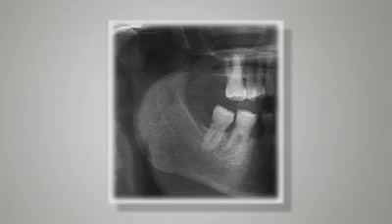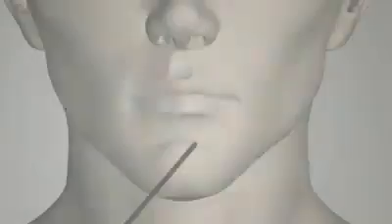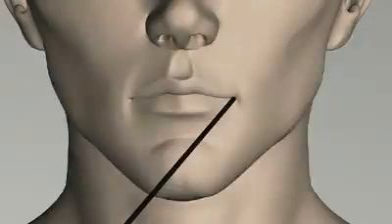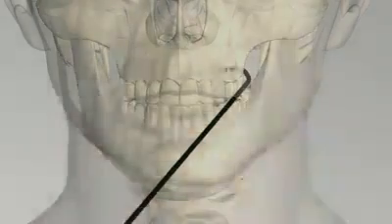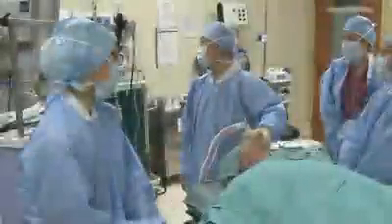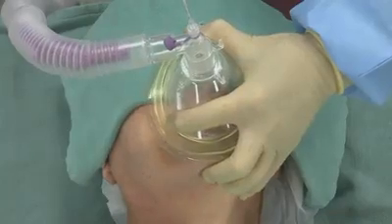Examine the patient and ask him to insert the fifth digit behind the last molar on both sides, choosing the sides with more room. This graphic shows the path of the fibroscope for retromolar intubation: from the retromolar space to the pharyngeal cavity, towards the glottic opening and into the trachea. This video will demonstrate the technique for retromolar flexible fiberoptic intubation.